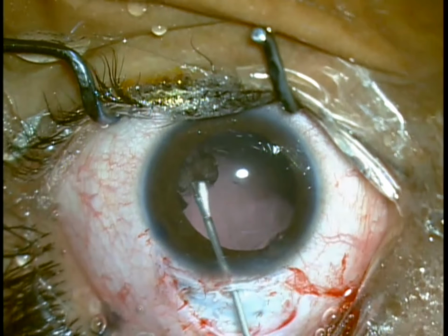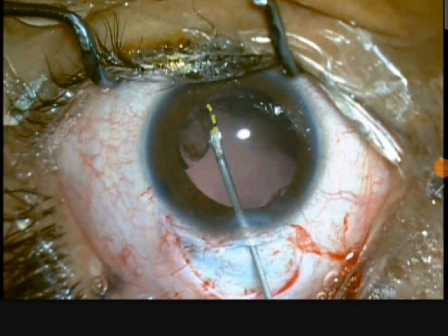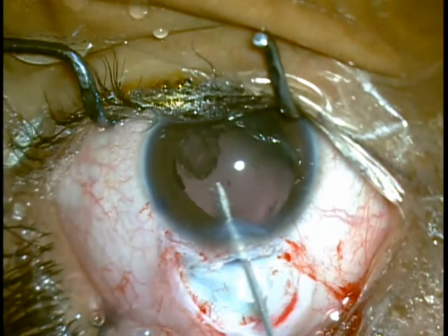With the help of micro scissors, the visible portion of the cyst along with the posterior capsule of the lens in that area is cut and removed. This sample is later sent for histopathological evaluation.